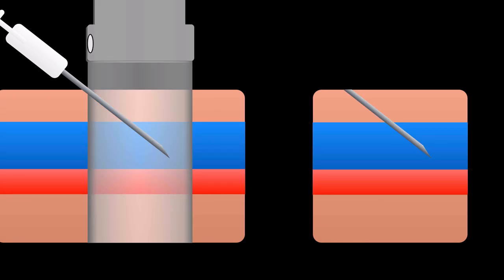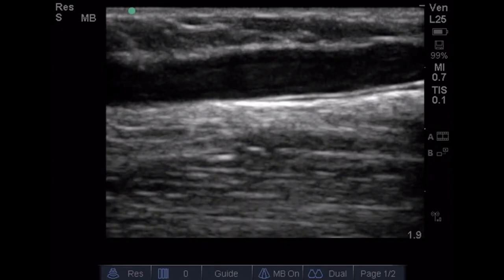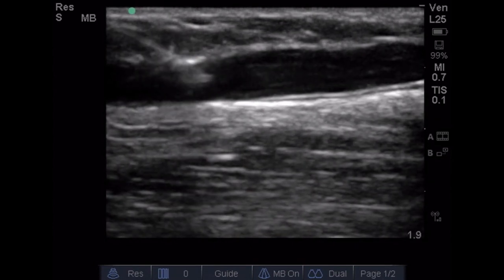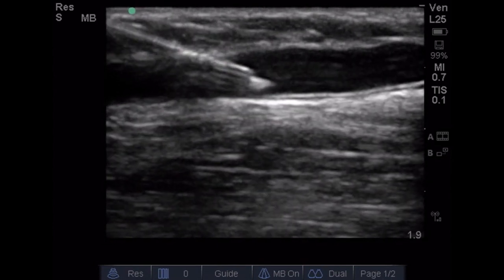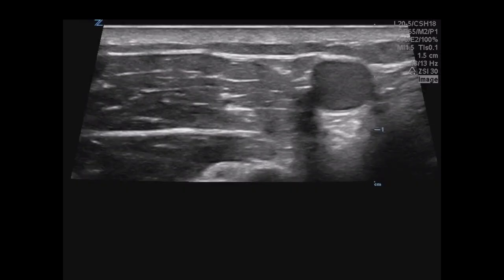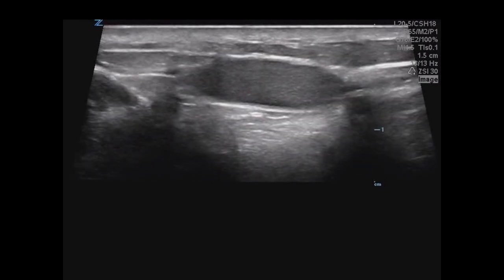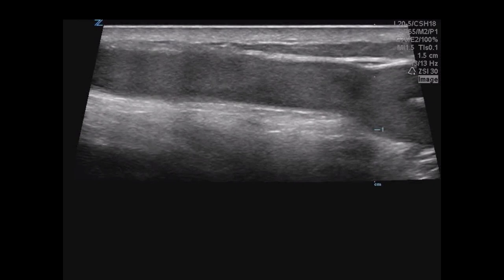The sagittal or in-plane approach allows visualization of the entire needle shaft all the way to the tip, confirming the tip is within the vessel lumen and not through the back wall. The limitation is that the ultrasound beam is very thin, and if you're not facile at probe manipulation, you may lose sight of the needle. This is a skill that needs practice. In-plane visualization lets you watch the needle tip puncture the vessel and thread your catheter, reducing complications. Rotate from transverse to sagittal by centering the vessel and rotating the probe, watching the circle extend into a long oval.